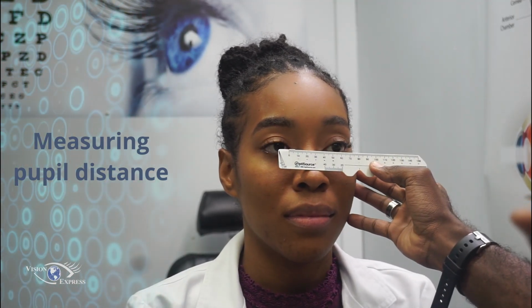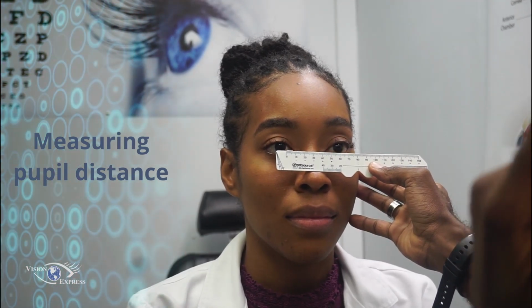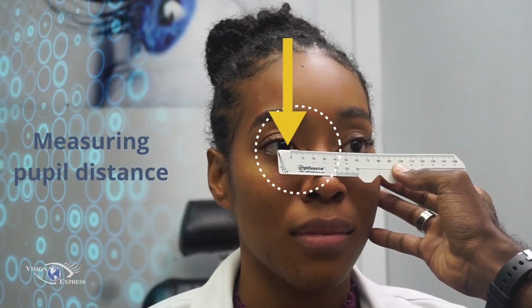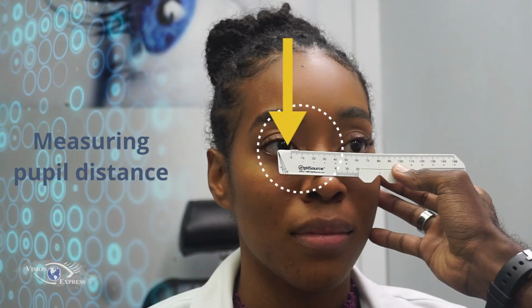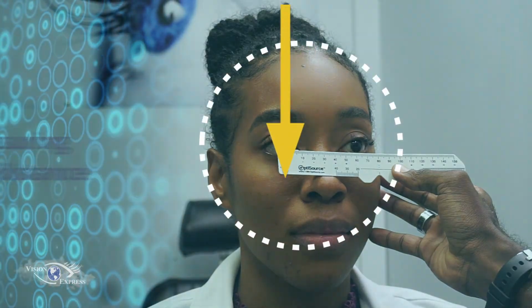Measurements. The first measurement we will look at is the pupil distance, or PD. In measuring the PD, have the patient look at your left eye. Rest the ruler on the patient's bridge for support. Begin measuring from the center of the patient's right pupil. Then direct his or her eyes to your right eye. Proceed to measure the center of the left pupil.